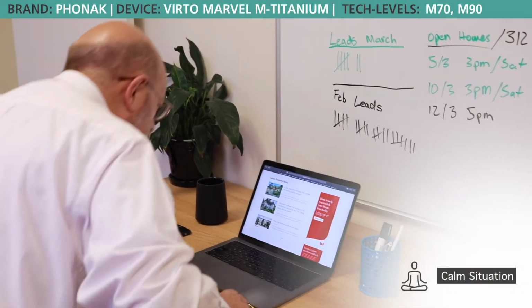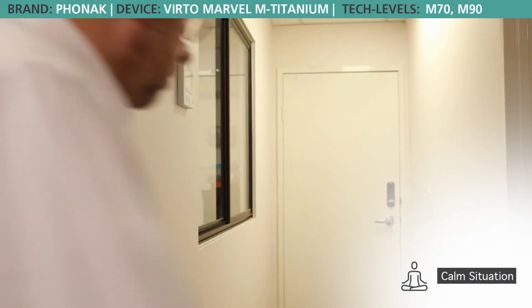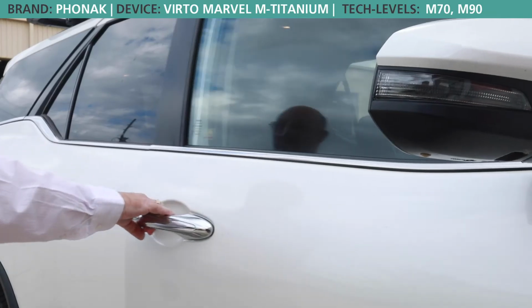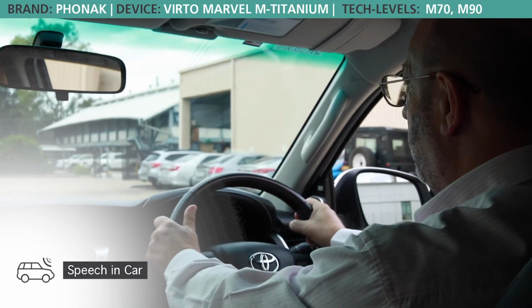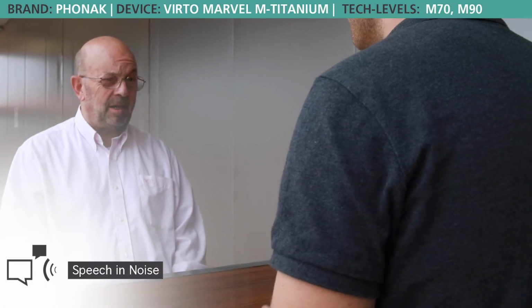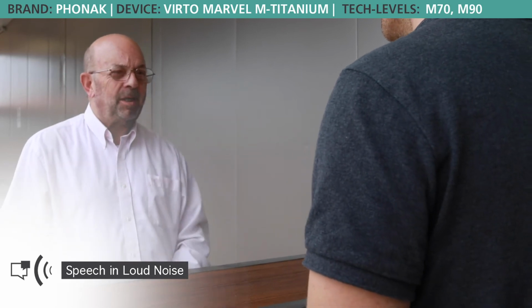So as a real estate agent, he's working in a quiet office and he needs to go to an appointment. So he leaves a calm environment program in his office, then jumps into his car. The hearing aid then automatically switches into a speech in car program. The real estate agent then jumps out of his car and enters a noisy cafe to meet with a potential new client. The hearing aid will then switch to a speech in noise or speech in loud noise program, depending upon the technology level of the hearing aid that the real estate agent has chosen.